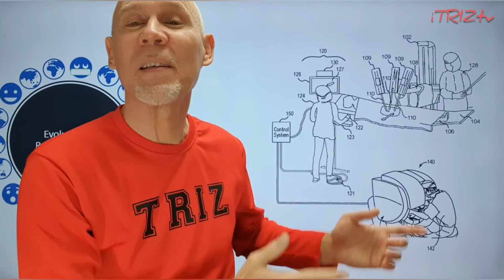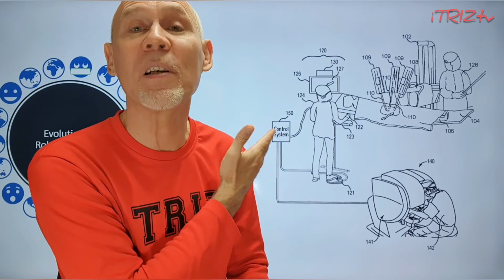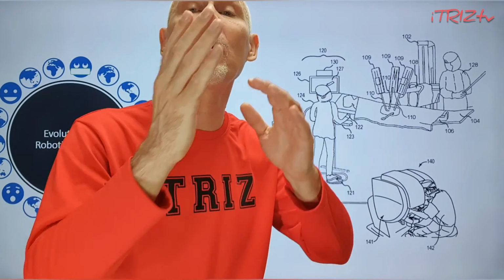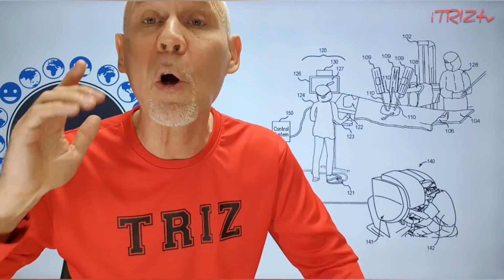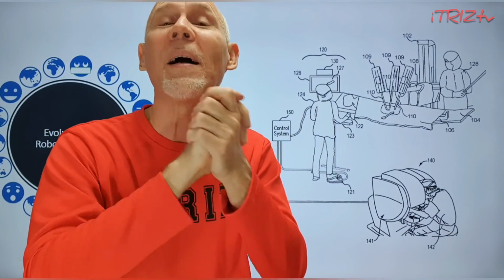I think that here we can talk about a trend of displacement of the human from the system. And as you can see in this example of transition toward robotically assisted surgical operations, usually it is extremely difficult or almost impossible to have a transition from operations carried out by a human surgeon to operations carried out by a robot surgeon without replacing the main principle of operation. That's why I hope you noticed how surgical tools for manual operations are hybridized with the new robotic approach.